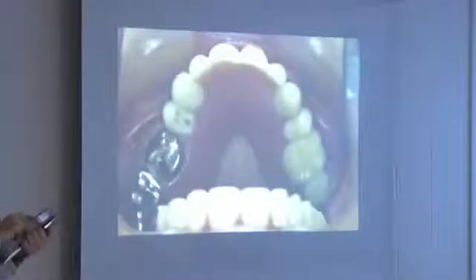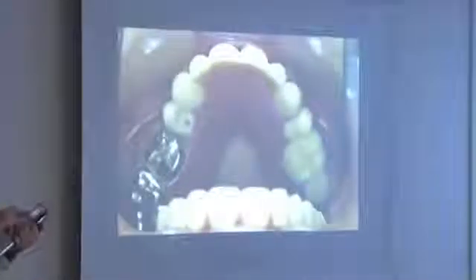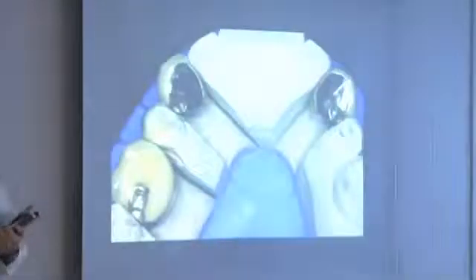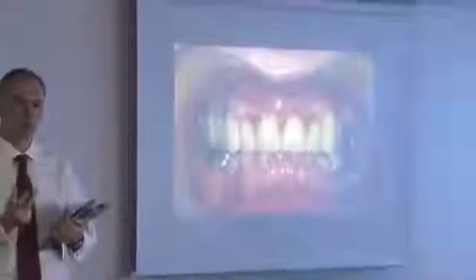And you can see, we make that fit very nicely. There's a gap there that comes together. Technicians will then produce these crowns, and they build these really, really meaty lock-in rest seats. We'll come back, I'll fit the crowns, looks just like temporaries. We've got control of the aesthetics.